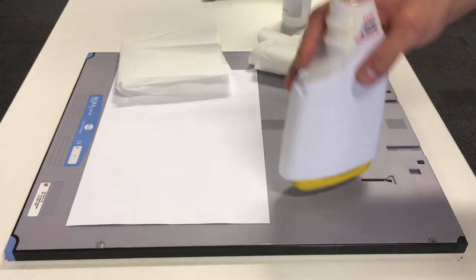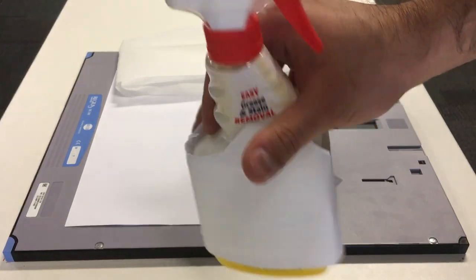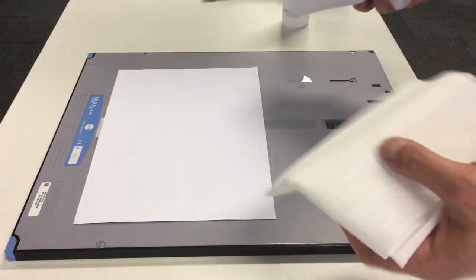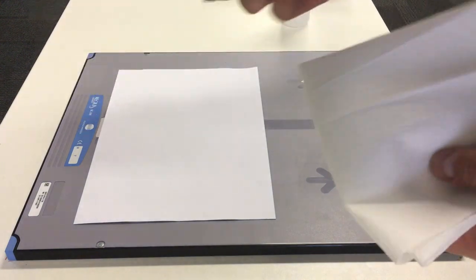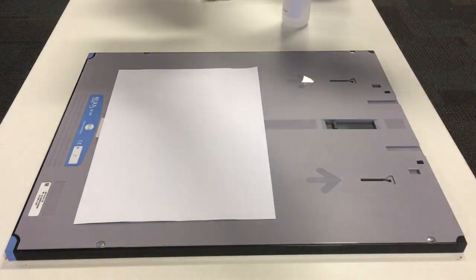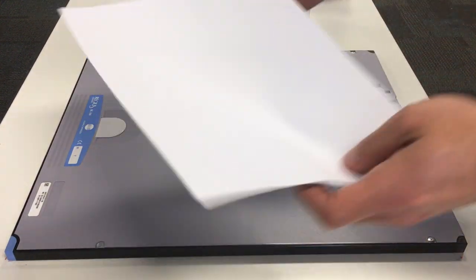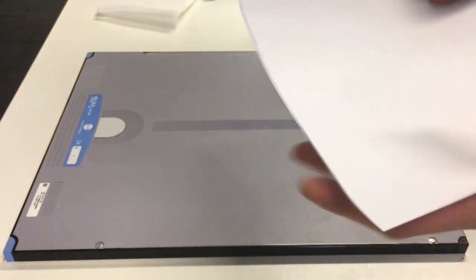And we have just a general-purpose cleaner, and we've got two lint-free cloths and we've got a piece of paper as well in case you need it.